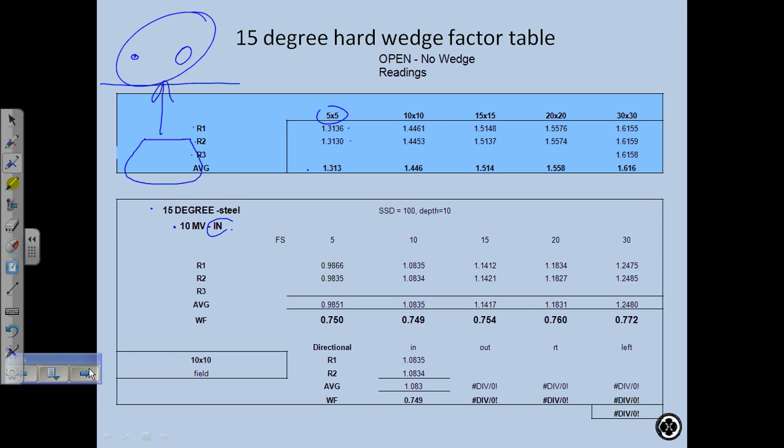It's right. Okay. It's hard to start here. Always start with the gantry up here. Okay. So gantry's up here now. And then if I use a right wedge, it means my toe's here, my heel's here. If I rotate this around to this position, this wedge comes around, the toe is here, and the heel is here. So this is a right wedge, right? We agree with that, because this toe is on the right side of the patient. And then we rotate around, and it looks like that.